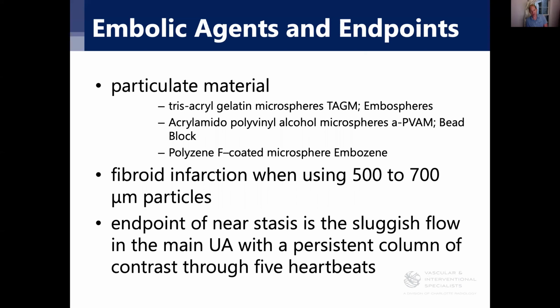So our idea here is to starve the fibroids and preserve the rest of the tissue, because that's really the advantage of uterine artery embolization. The uterus actually functions normally, more like myomectomy, not like a hysterectomy, and there's no reason to cause that much ischemia of the rest of the tissues. So this endpoint is very key. This is a big difference as far as pain control afterwards.